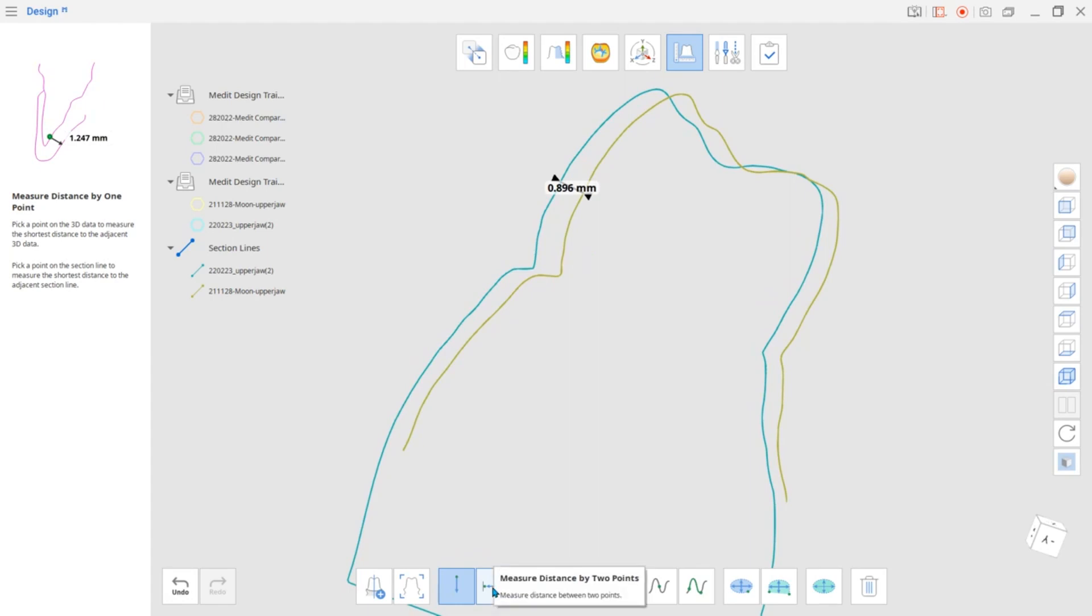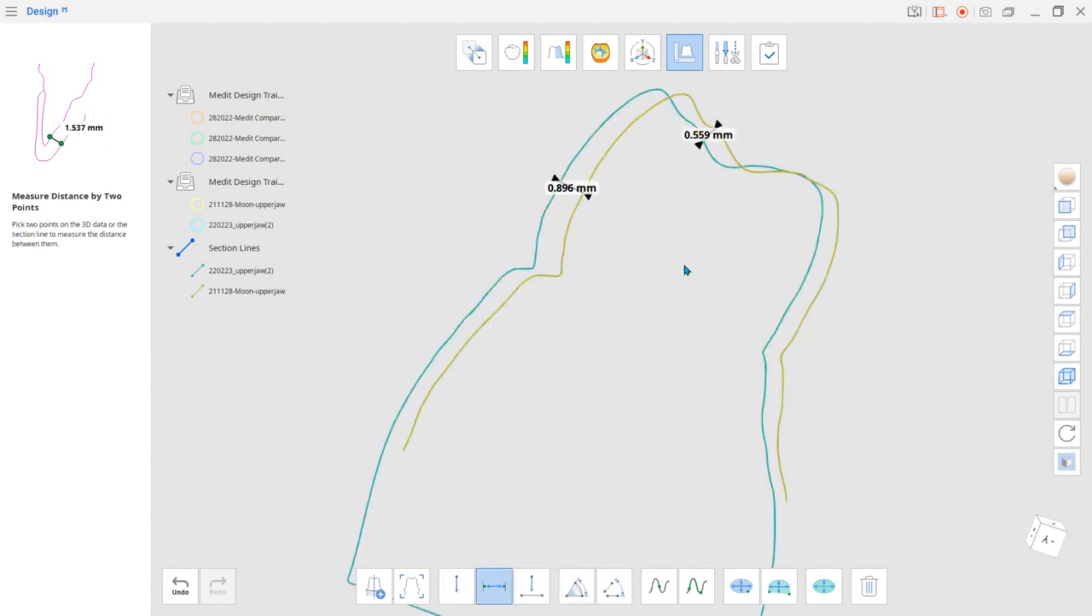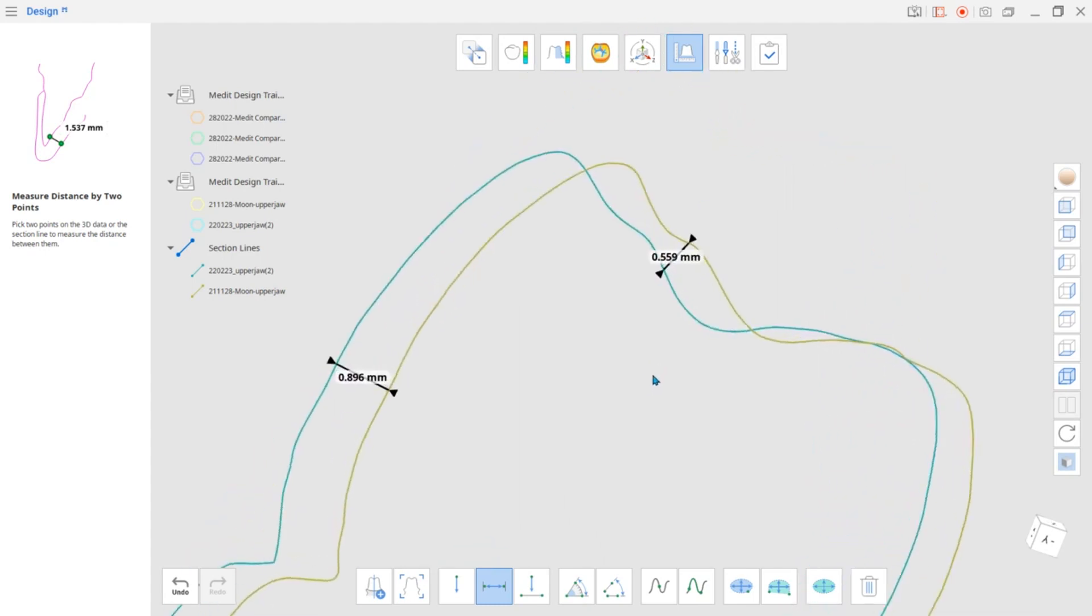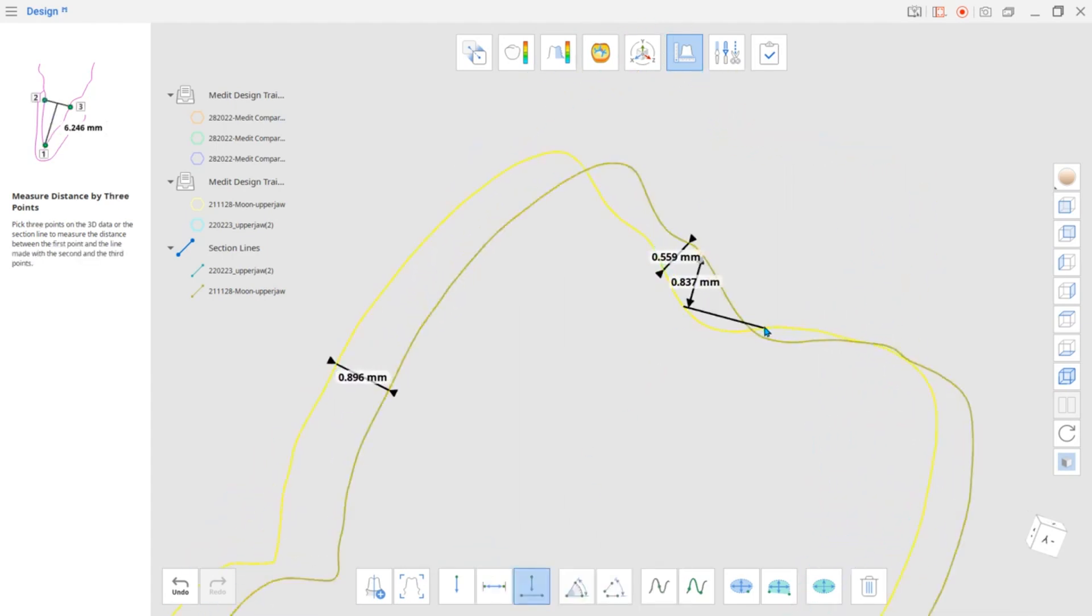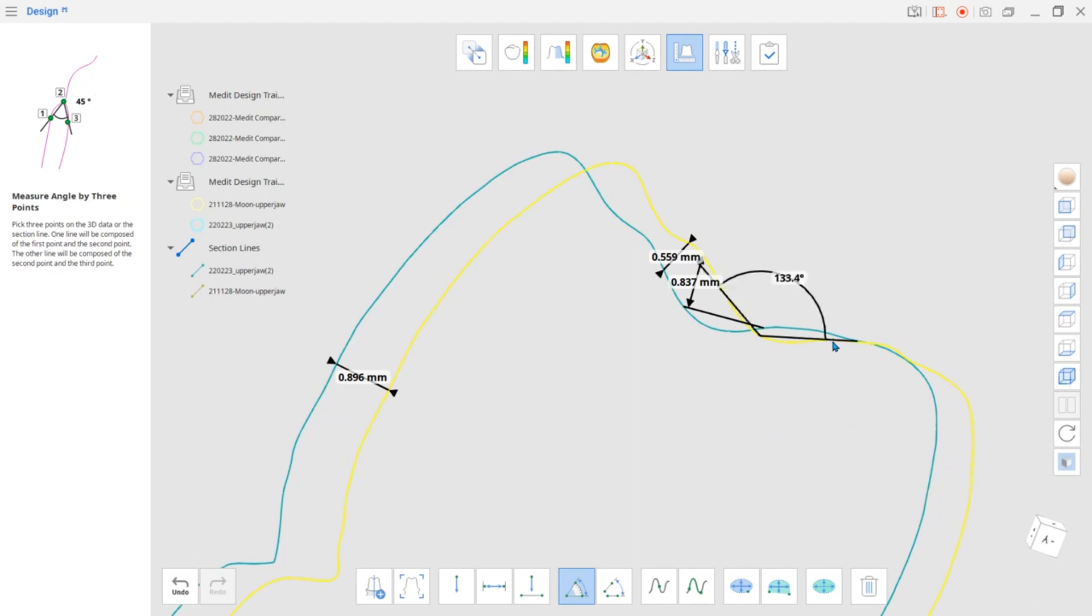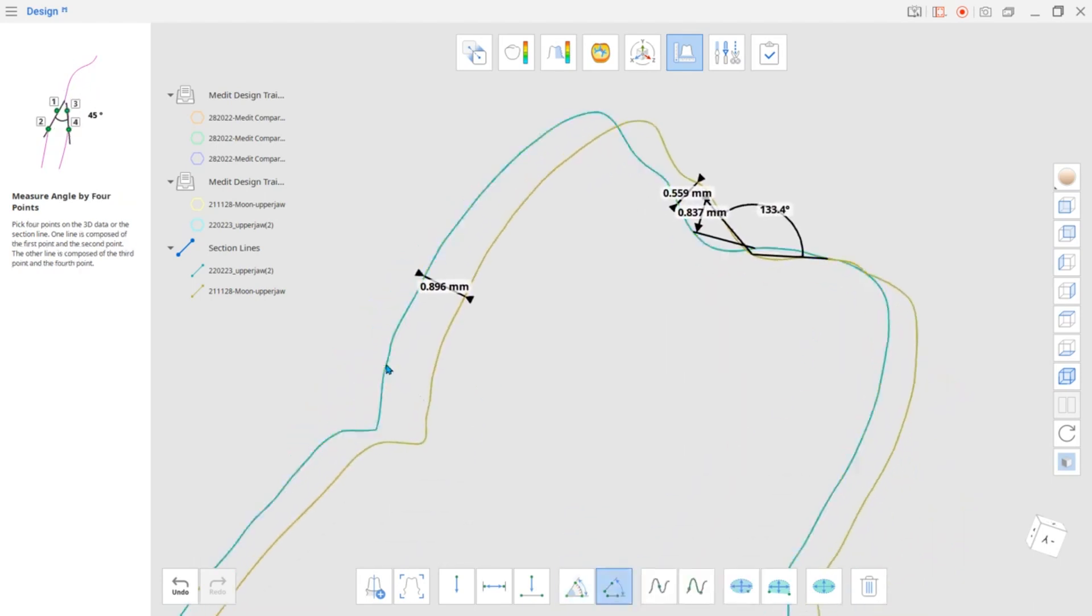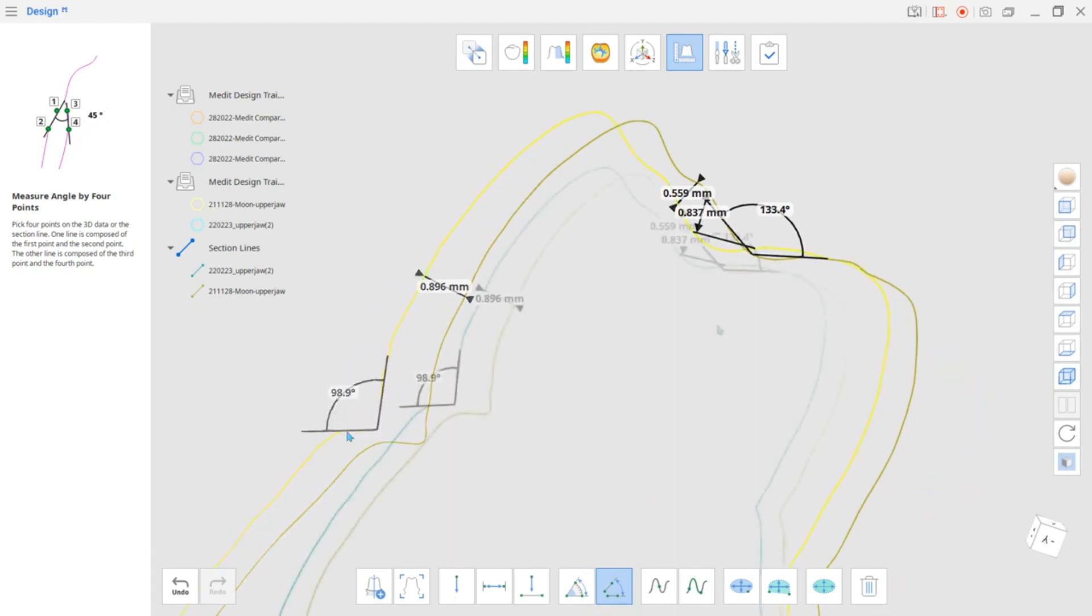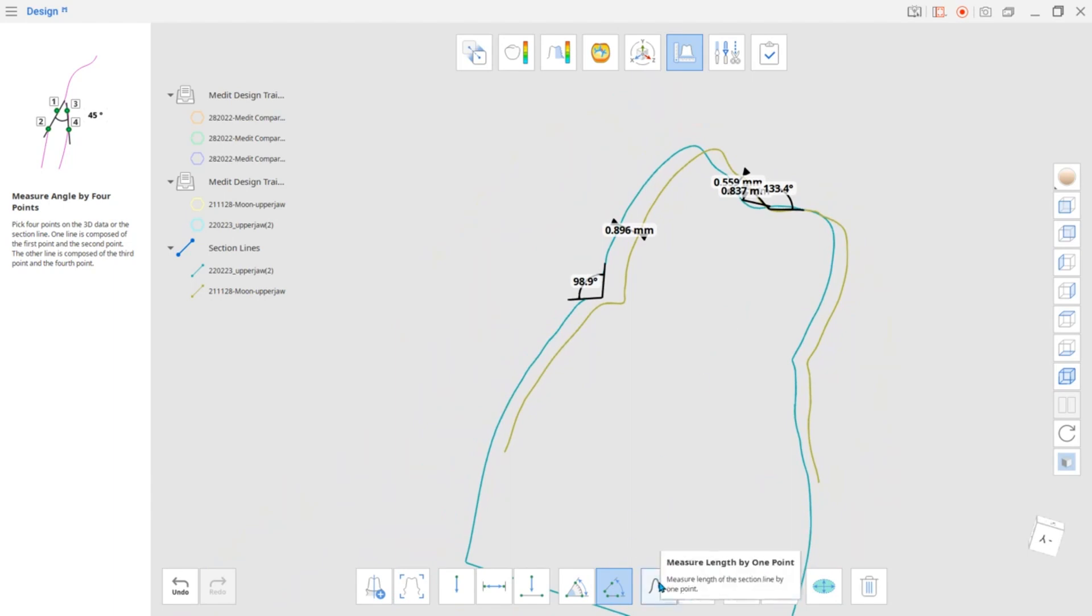You can do measurements based on one, two or three points on the line. You can also take measurements of the angles and the length of the section line.